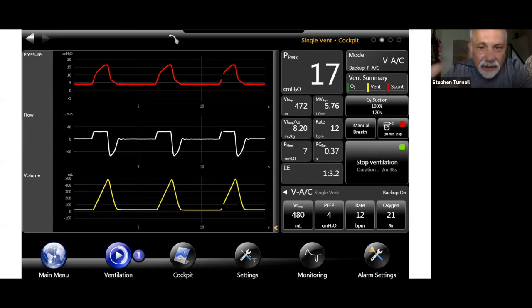I also know that on the expiratory side, for the spirometry elements, at some point we have to pick a point to stop integrating the flow over time to give you a volume. And that's the engineer's guess. Usually a 5 liters per minute cutoff is pretty good, but you could potentially continue to have a leak of less than 5 liters per minute that's not shown by certain ventilators.